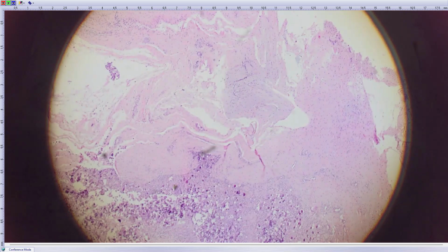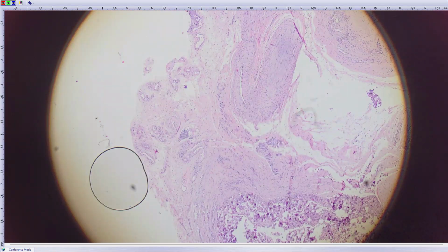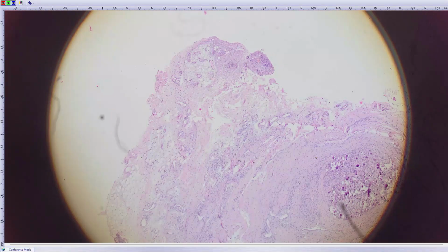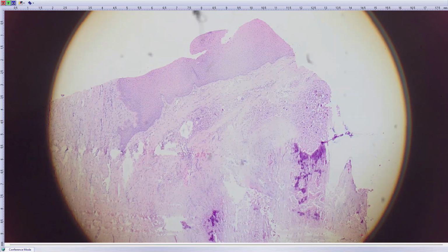Okay, next case. It's a middle-aged woman in her 50s, with a small tumor on her fingers. So far we have talked about generally quite serious sarcoma diagnoses. This one is kind of cute, a little innocent lesion, typically on the fingers of a middle-aged female.